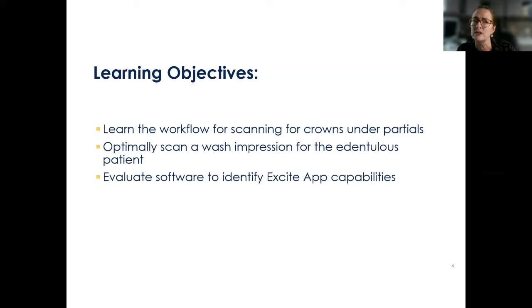And then lastly, to evaluate your software. How can you evaluate your 3Shape software to identify which Excite app capabilities you have on your particular system? Some come with the software that you purchased, and others are add-ons. So just to educate you on how to determine that.